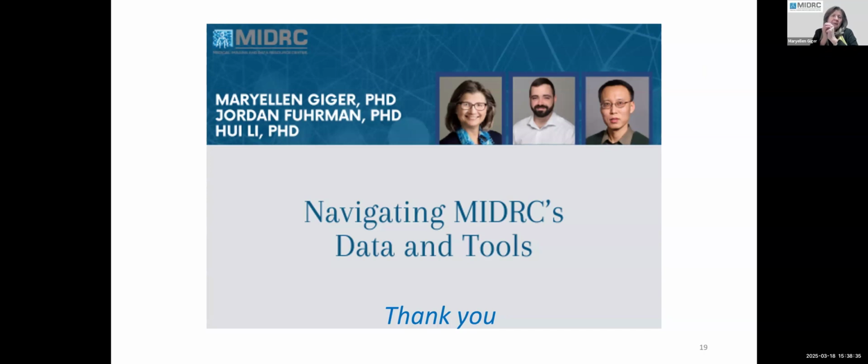Oh, yes. And we only covered 4 tools because we have limited time in these seminars. But we have a lot more tools, as you saw them fly by when Jordan went to the resource page. And we do the harmonization for the DICOM using LOINC based on the RadLex playbook. That is up on the GitHub. If you have data you want to harmonize, use that. So thank you, Ryan, for putting that in the questions.